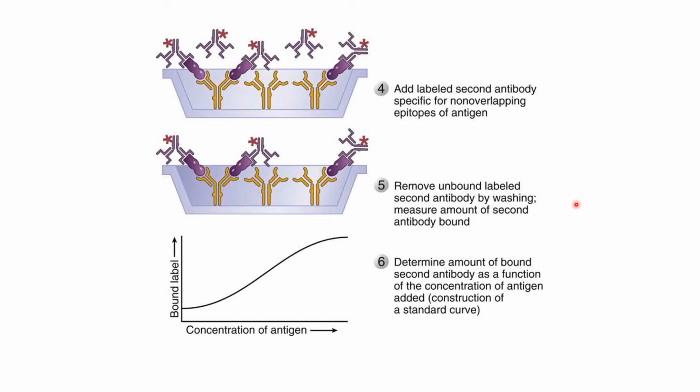And so if you happen to just join an immunology lab and you see a senior PhD student banging her plate like crazy on the bench, she either just had a frustrating meeting with her supervisor or she's just doing ELISA.